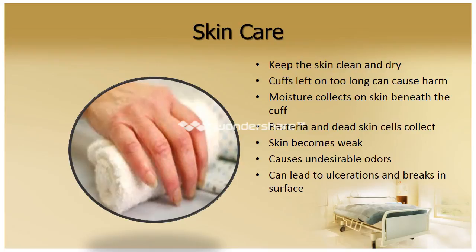This is important because if the patient begins to sweat, moisture collects beneath the cuff and the skin becomes weak and susceptible to damage. A foul odor can result, and a patient can end up having breakdown and infection. So we need to make sure that we're doing our part with keeping our patient's skin clean and dry.